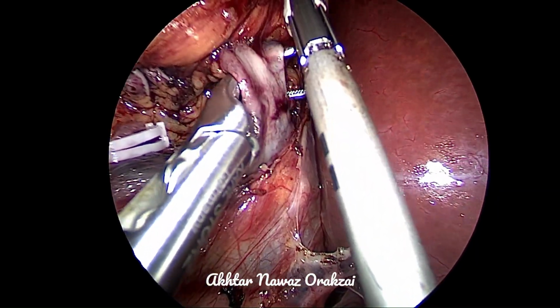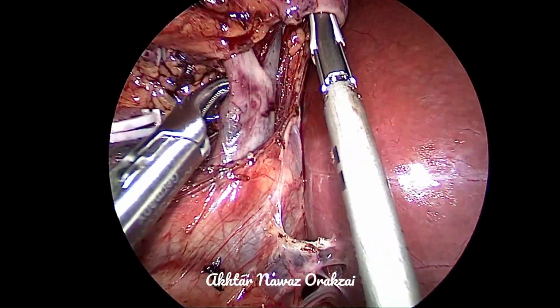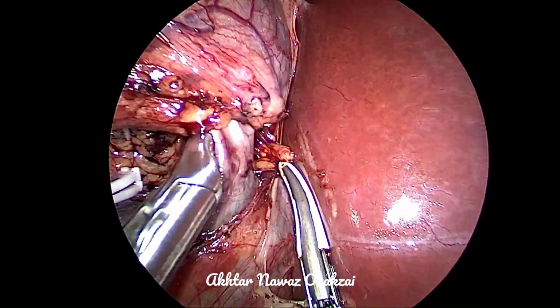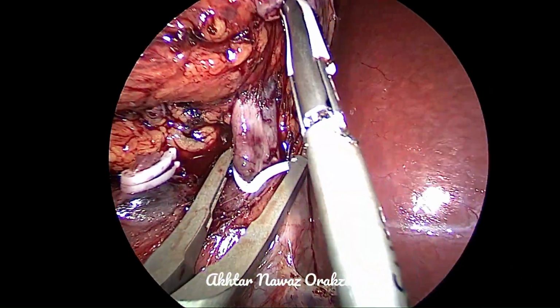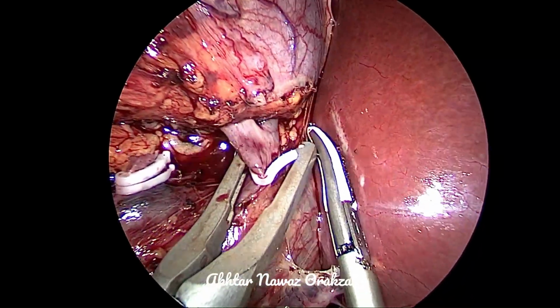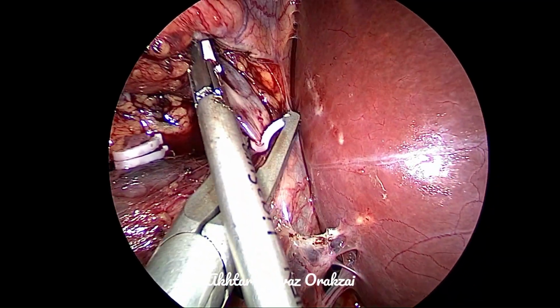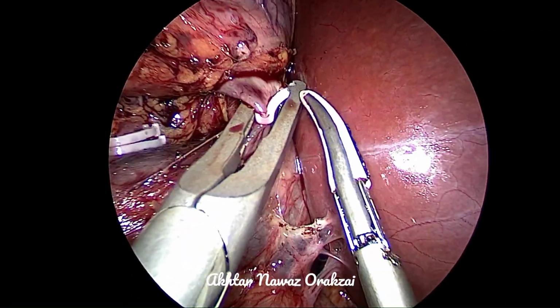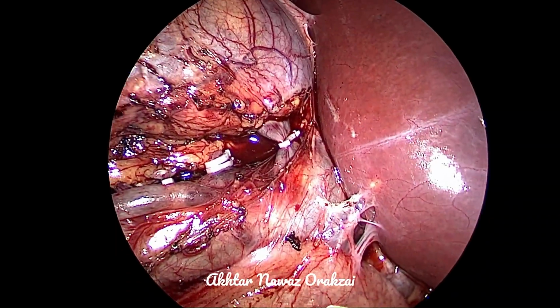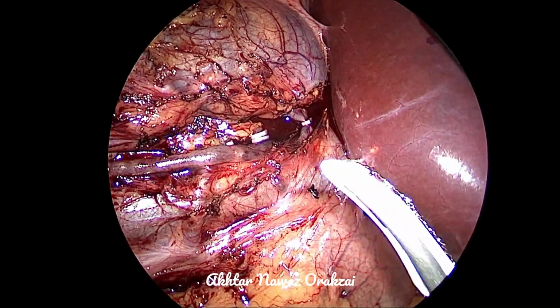For all these steps, it's important to put in the right ports at the right sides. So it is a right-sided nephrectomy. I put a 5 millimeter working port for my right hand, and a 10 millimeter port for my left hand, so that the Hem-o-lok clip can come in a linear fashion towards the vein, and the 10 millimeter right angle is also coming tangentially for the dissection.